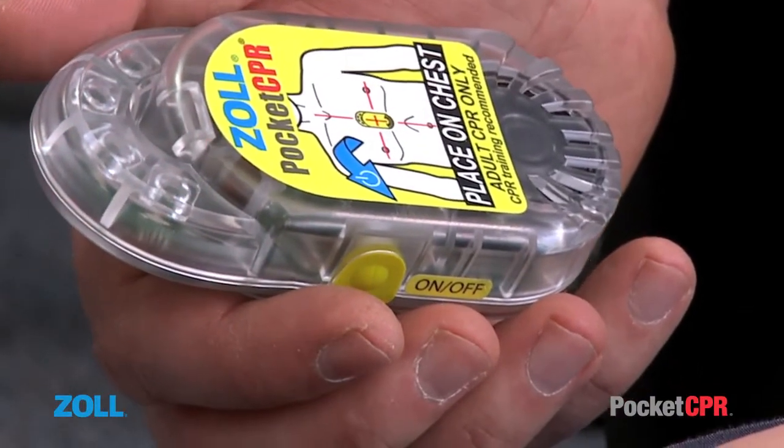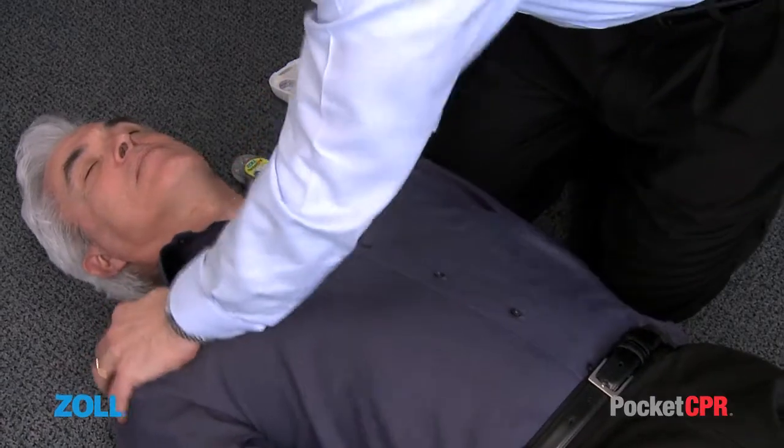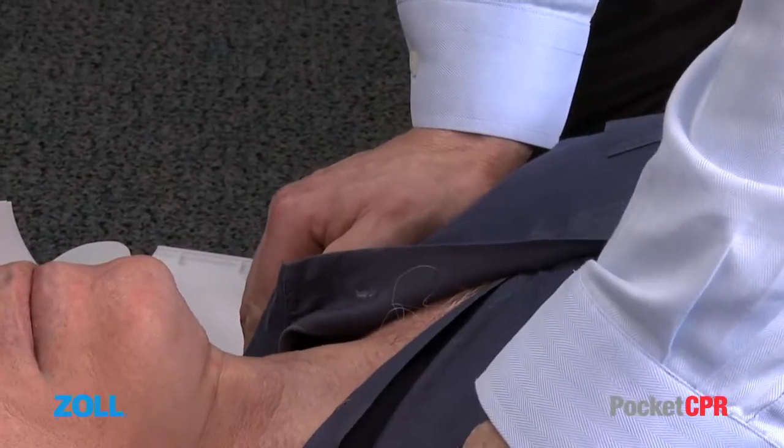Stay calm. Check responsiveness. Check responsiveness means gently shake the patient's shoulder, asking loudly if they can hear you or respond. Are you okay? Can you hear me?